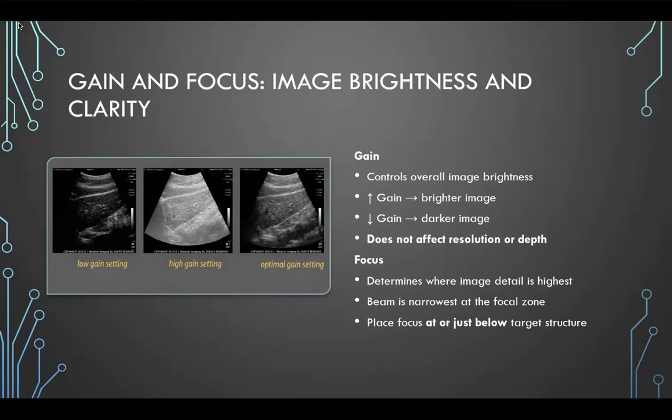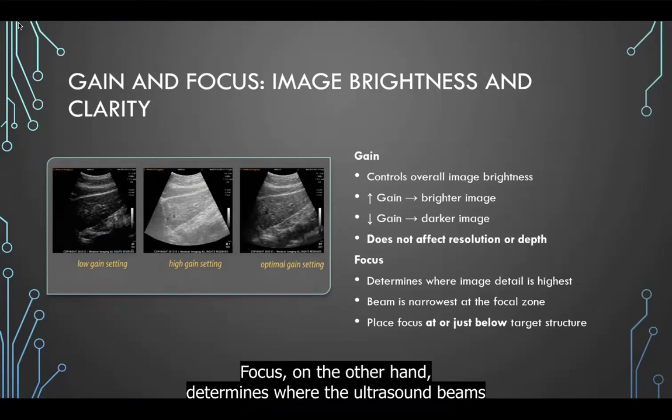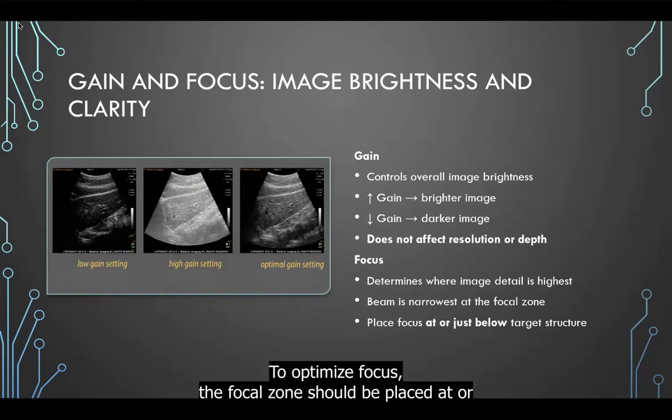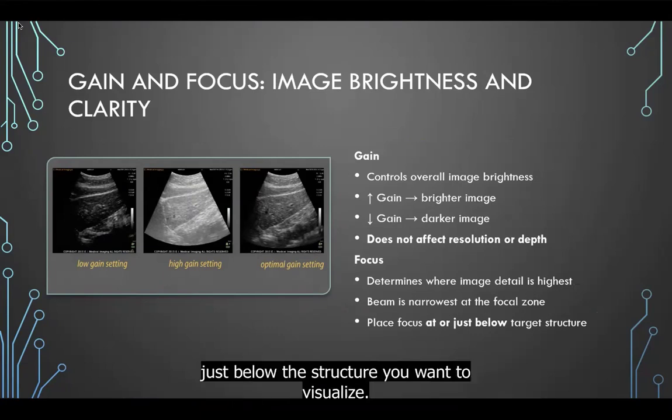Focus, on the other hand, determines where the ultrasound beam is narrowest and where the image detail is highest. To optimize focus, the focal zone should be placed at or just below the structure you want to visualize.